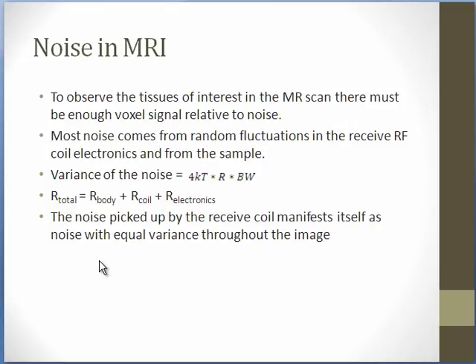And when we do that, the mathematics of the discrete Fourier transform, or the DFT, results in the noise. Well, not just the math, but obviously the physics of it as well. That result, when we're going from the signal domain to the image domain, is that the noise gets spread throughout the entire image.